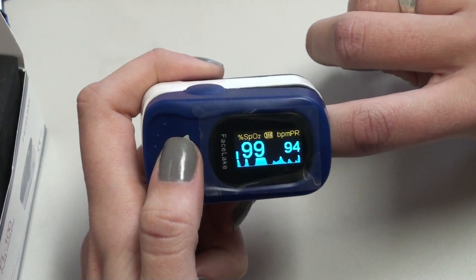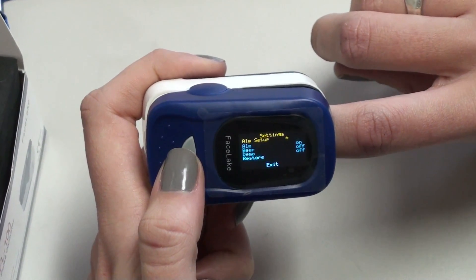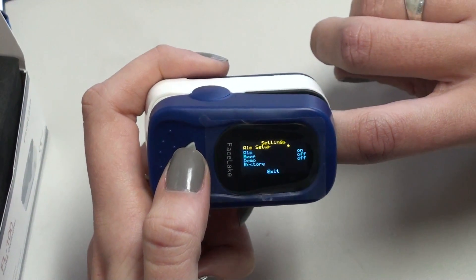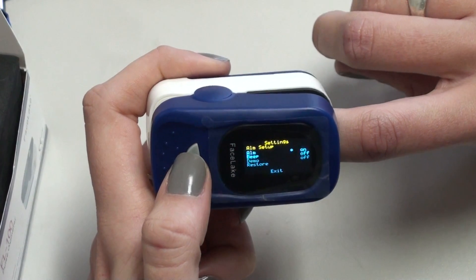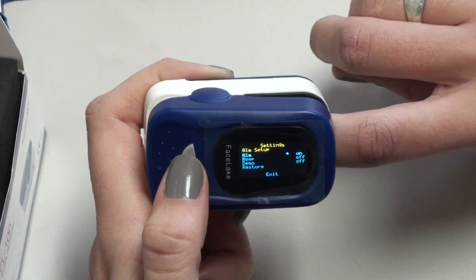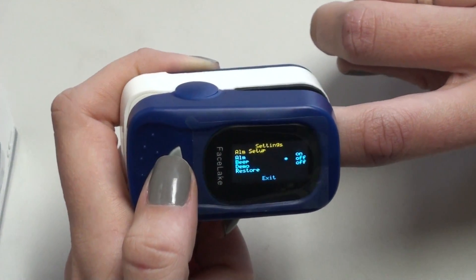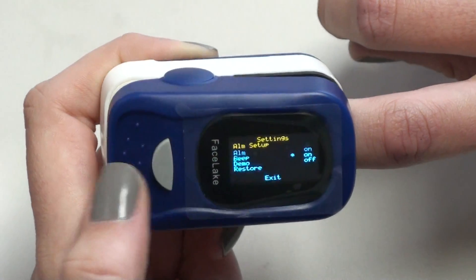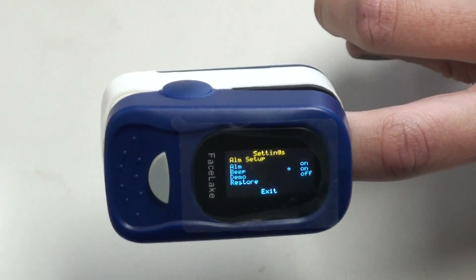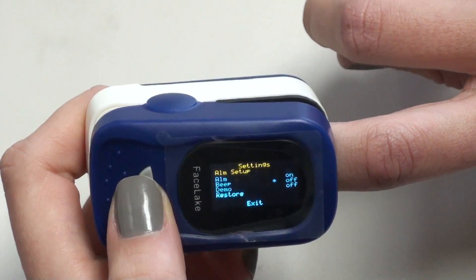Then you're going to hold down the button, and this will take you to the first setting where the alarm setup is. Hit the button once, and you can hold it down to turn the alarm setting on or off — we're going to turn it on. Then if you want a beep, you can hold down the button again to toggle it on or off.